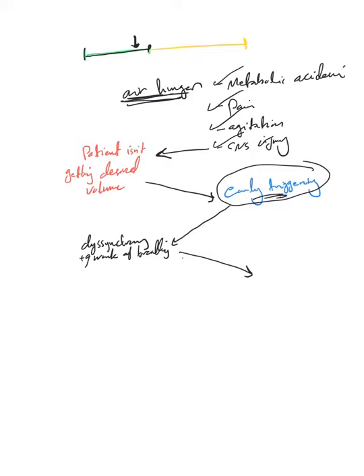But again, the ventilator here is unresponsive. This will lead to the patient not getting the desired volume, and that's why he's trying to breathe more to get that volume. This will lead to significant dyssynchrony and significantly increased work of breathing. This will make things worse, not better.